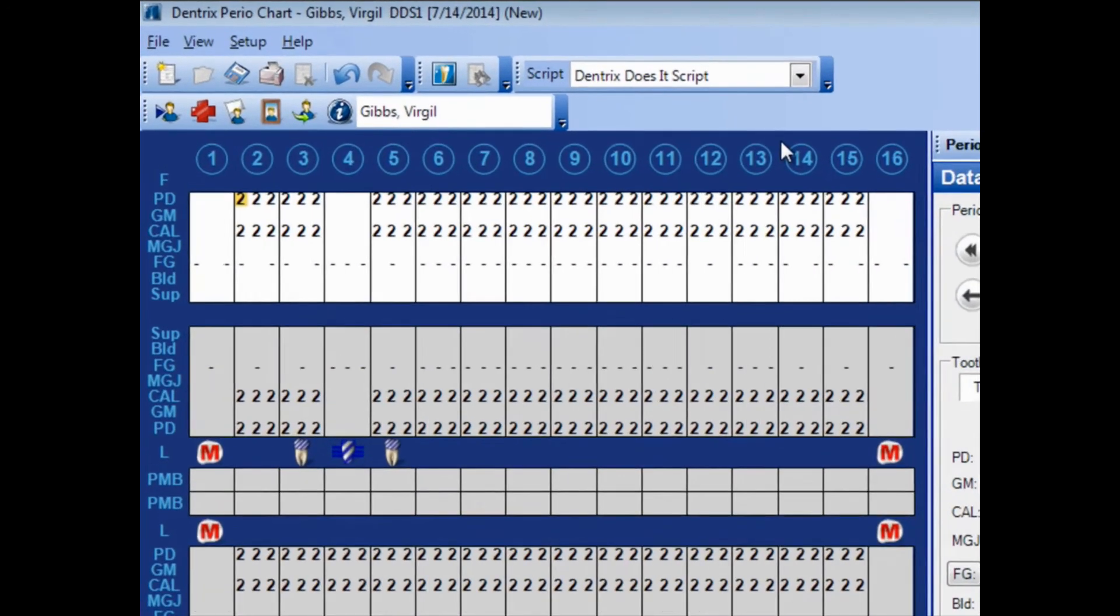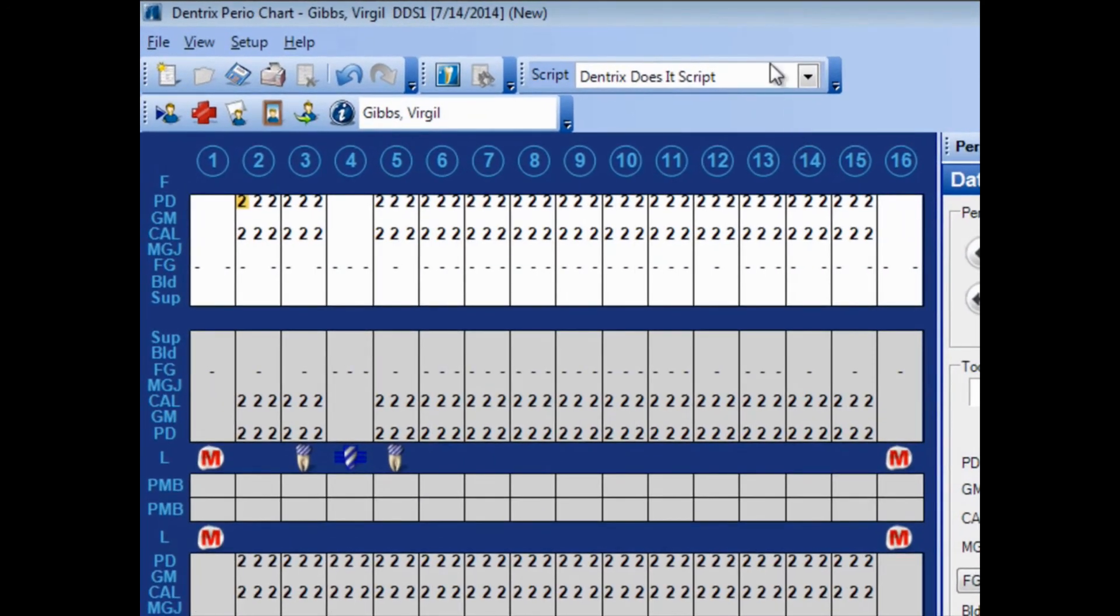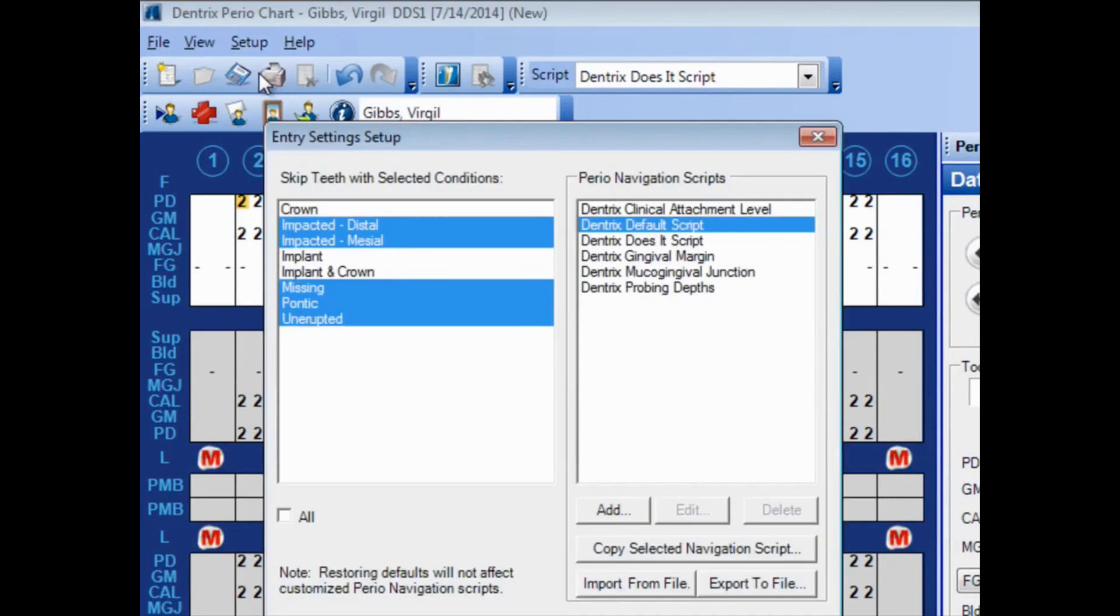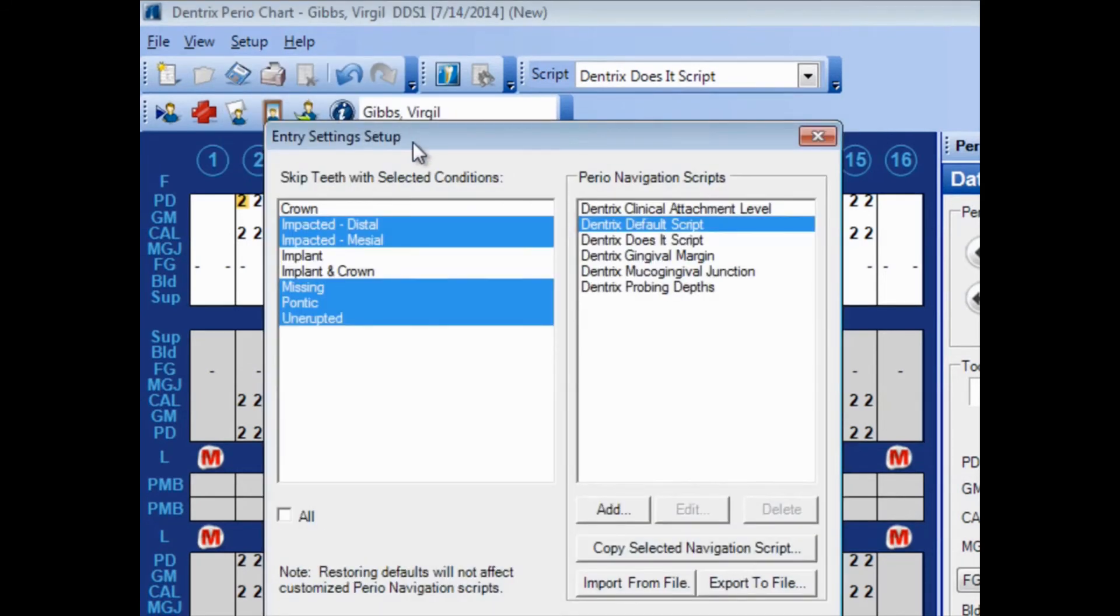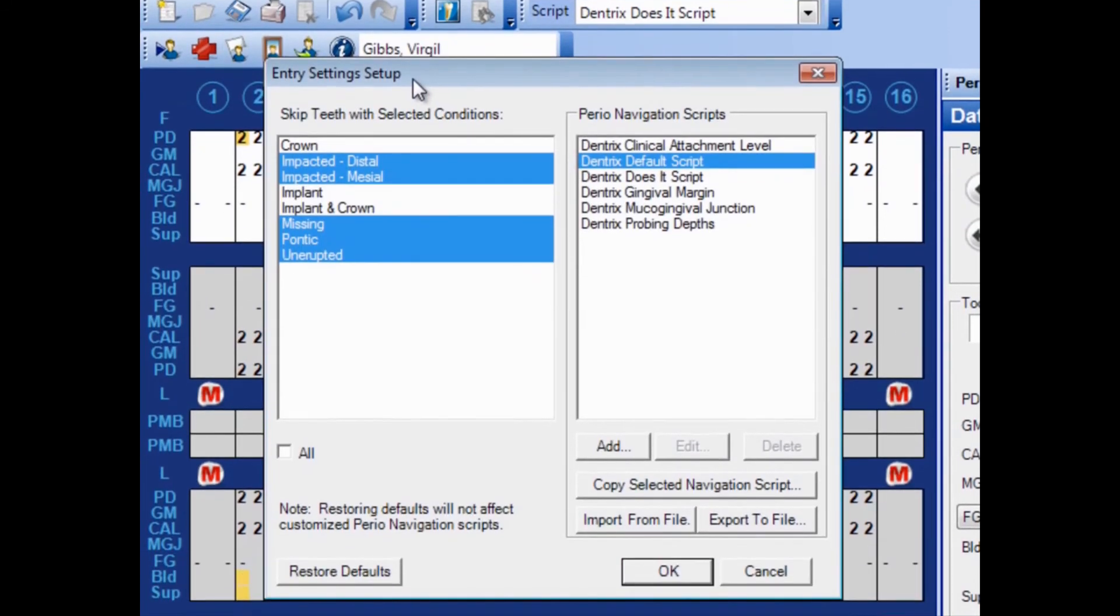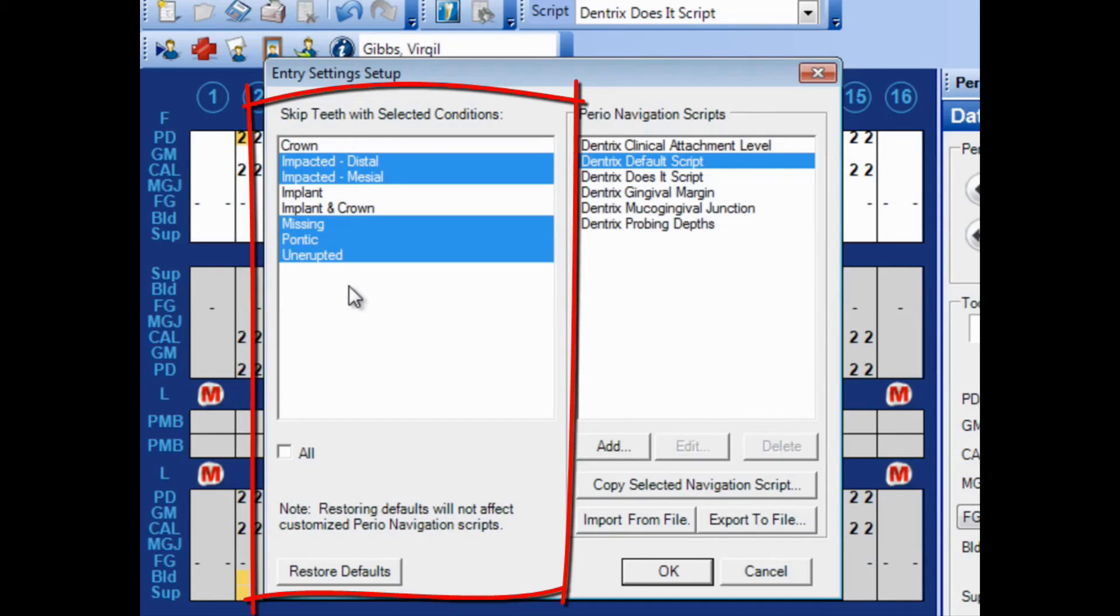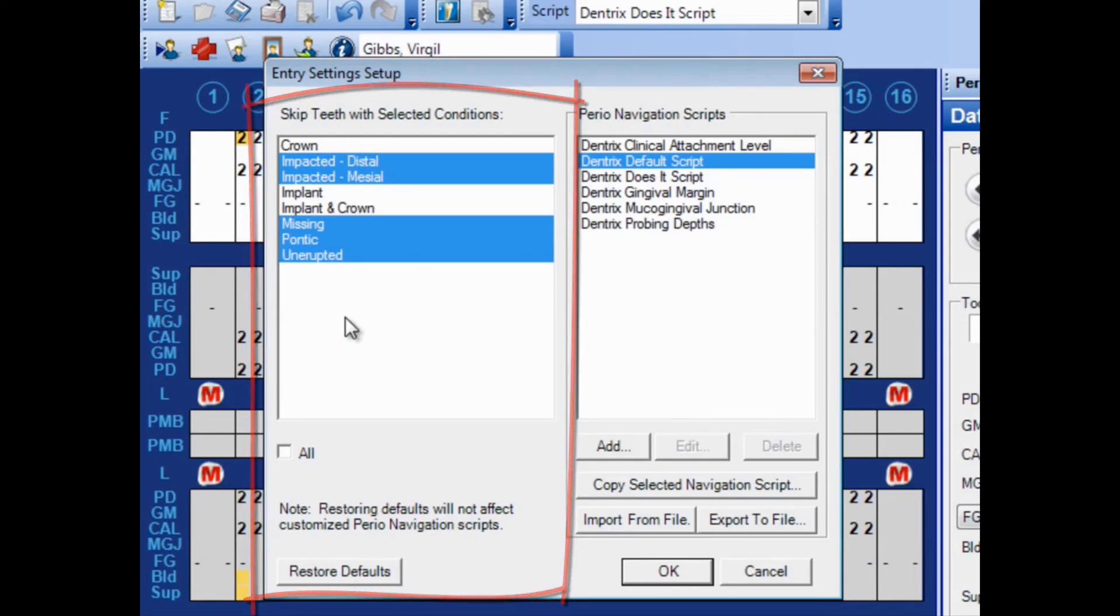In fact, let me show you that. Back in Setup and Entry Settings Setup. Here on the left side, you can choose to skip teeth with certain conditions. And if those conditions have been charted within the tooth chart for the patient, that information carries over and you have the flexibility there to choose which of these items to skip. If you click Restore Defaults here at the bottom, it will restore from this left-hand menu the default options as you see them here.